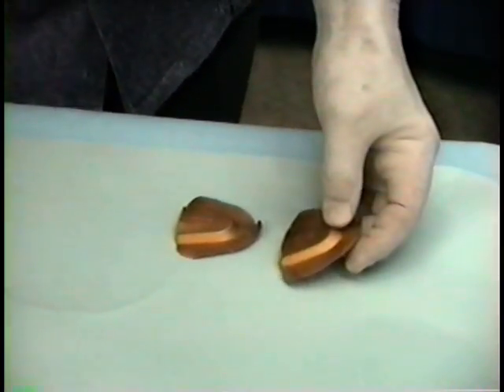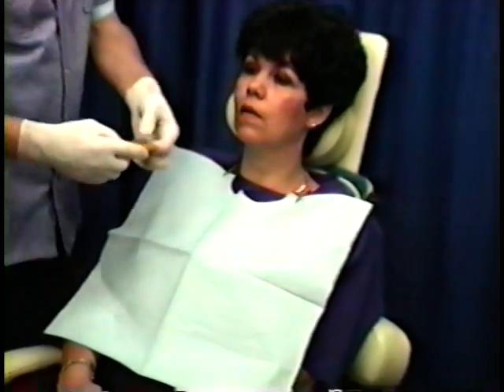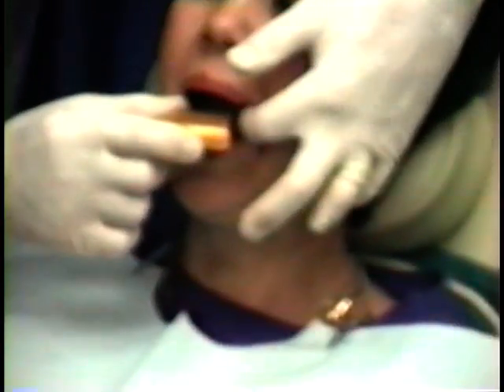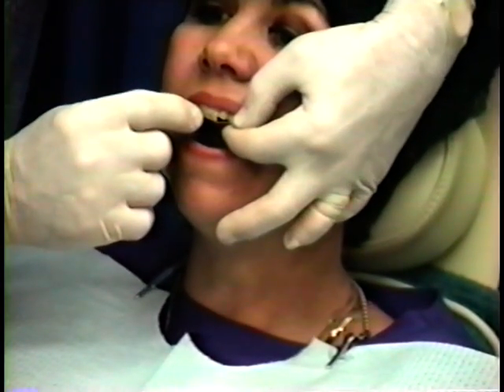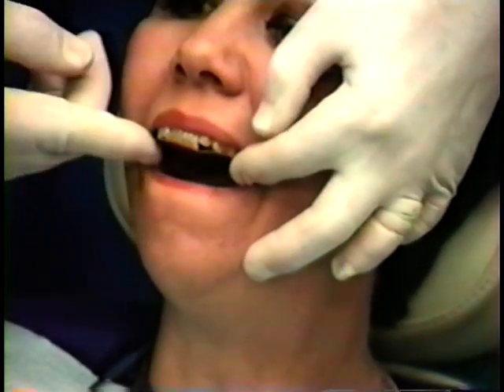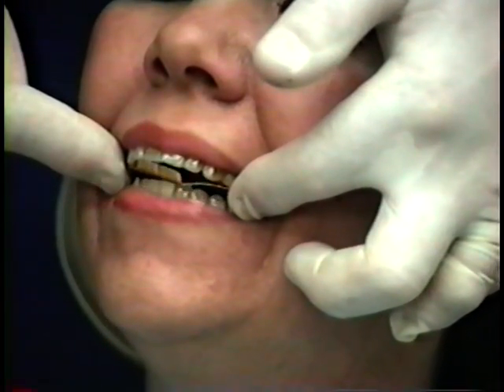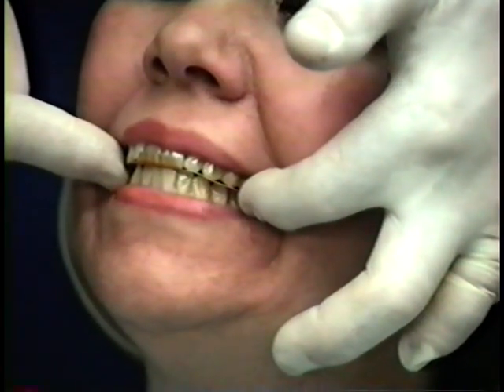Following that, we can go directly to the mouth. We grip the tray at the small serrated areas on either side, place it into the patient's mouth, and bring the flange against the maxillary teeth to the midline mark. Bring the index fingers to the side of the tray and have the patient crush the tray as hard as possible to conform to the teeth.